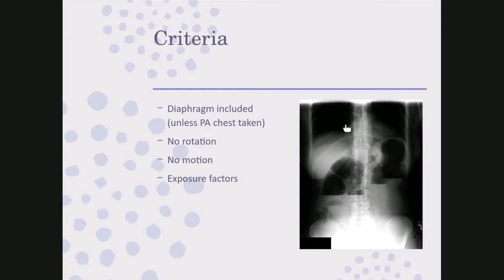So no air is seen in there, but if there was air right in this area, that would be the highest level it could rise because it couldn't go above the diaphragm because it's trapped in the peritoneum. So it would rise right here between the liver and the right hemidiaphragm. And that would be your either left lateral decubitus or an erect abdomen.